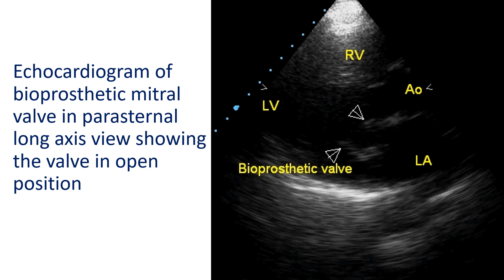Echocardiogram of a bioprosthetic mitral valve in parasternal long axis view showing the mitral valve in open position. Bioprosthetic valves can be with or without stents. This image is from a stented bioprosthetic valve. The porcine valve is fixed in glutaraldehyde, and the low profile stent is made up of an acetyl homopolymer.